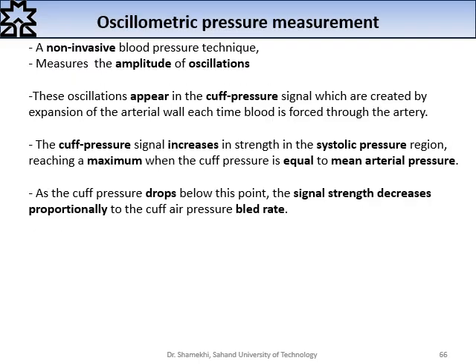Oscillometric pressure measurement is another blood pressure measurement method, and it is a very common method for blood pressure measuring.